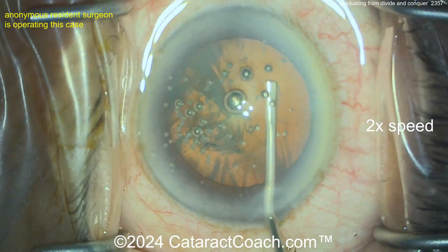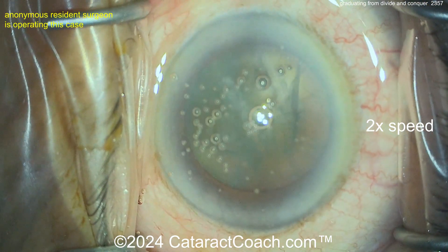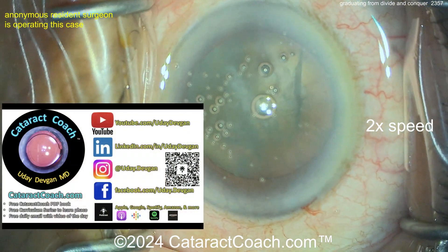That's a beautiful-looking rhexis — proud of you. Now let's see what we've got here. We're going to do some hydrodissection. Here's a bent cannula with a flattened end — some hydrodissection, get that nucleus to spin.